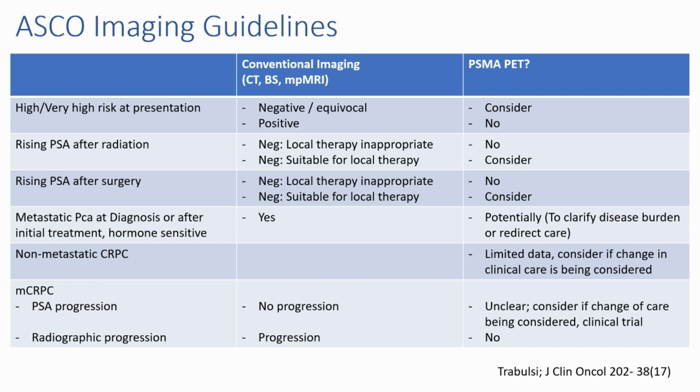For non-metastatic castrate-resistant prostate cancer, there's really limited data, and so you can once again consider it if a change of clinical care is being considered. And then for metastatic castrate-resistant prostate cancer, if there's no progression, it's unclear the role. If there's progression, there's no real role for PSMA PET.